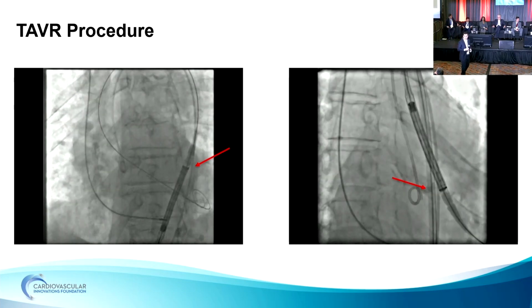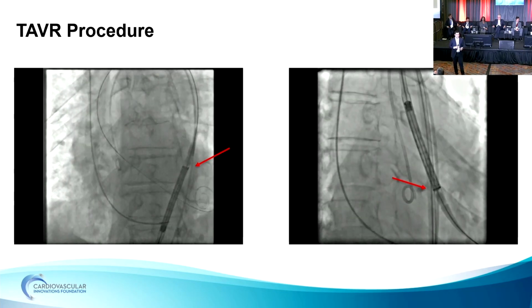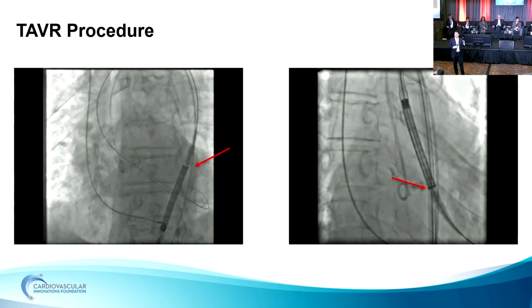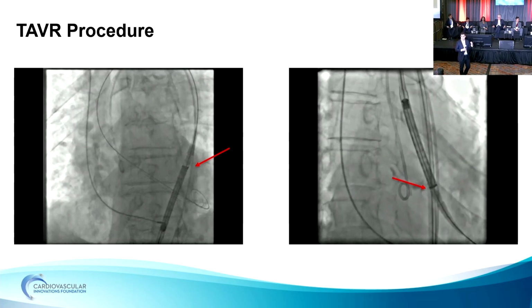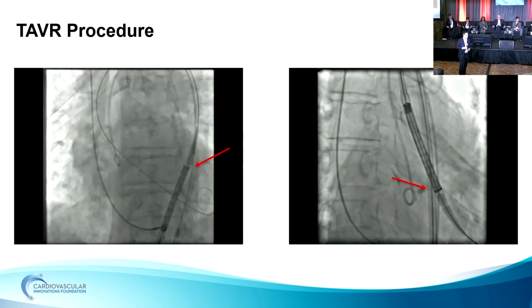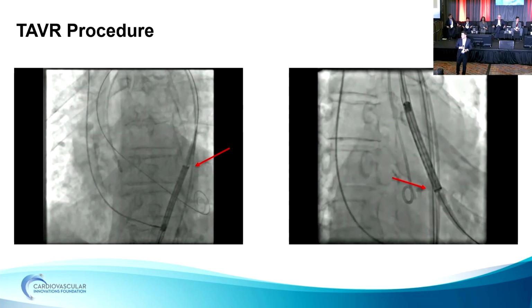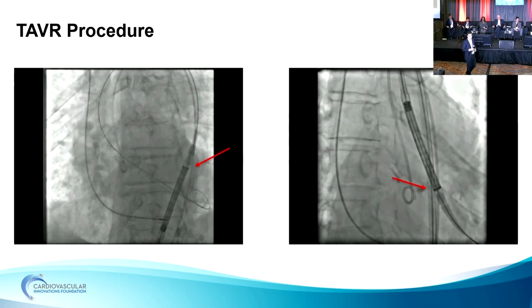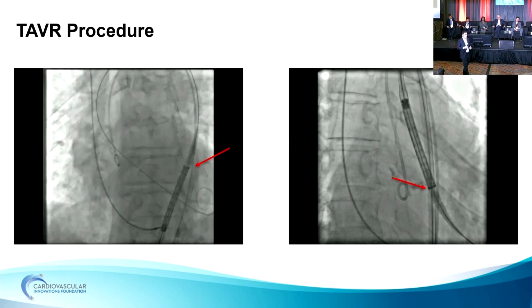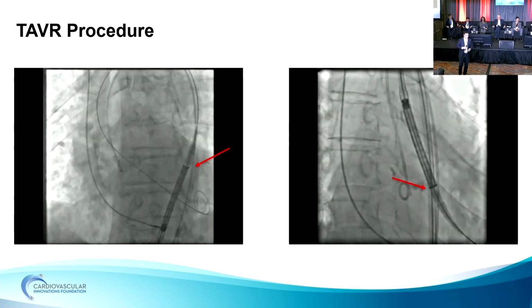There's a little hat marker on the side of the valve, for those that are not familiar, that we look at in the descending aorta as well as right on top of the aortic valve. We make sure it's sitting on the outer curve of the valve, and that allows us to ensure, to a good extent, that we'll get commissural alignment. I'll touch a little bit more on commissural alignment in a few minutes, and why it is important to everything else we do and everything else that anybody who would want to get access to coronaries will have to do.